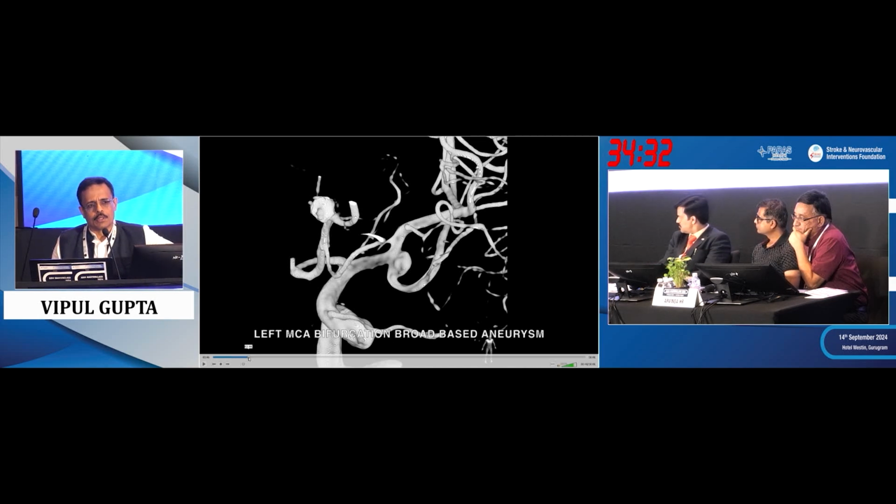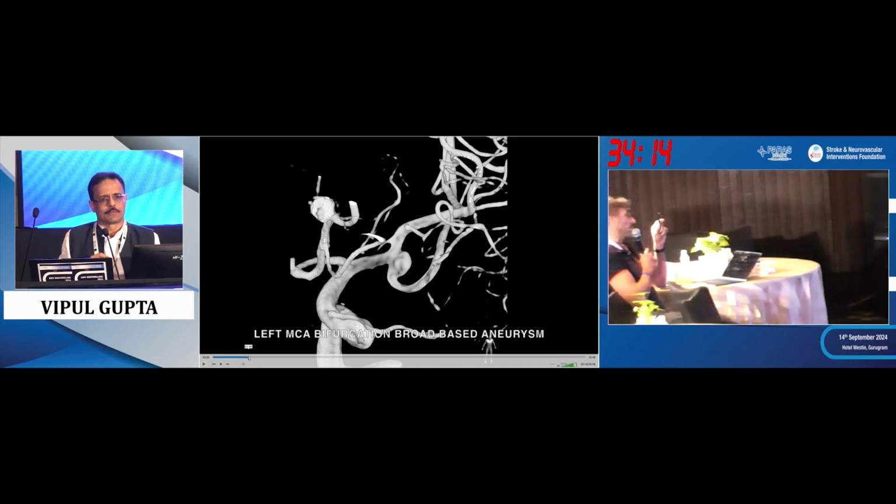All right, so yeah, I thought about a single stent, whether Atlas or anything else, but I was just worried, it is so shallow. Once I've deployed a stent, how many coils will I be able to place in it? Okay, you do it in simulation, you size the Atlas, and you see the size that allows you enough closing of the neck at or against the superior branch.